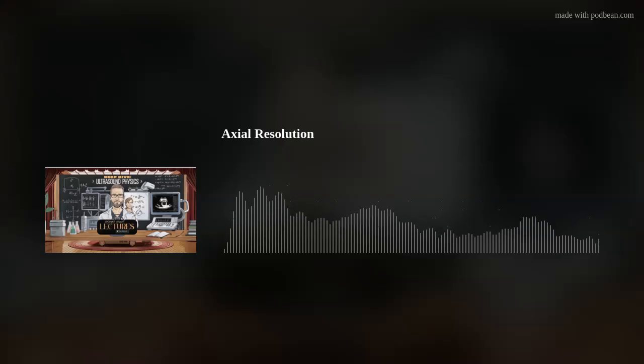No way! So the thickness of the crystal determines the frequency? Yeah, the crystal thickness is about half the wavelength it produces. Thinner crystal, higher frequency, shorter wavelength. Dude, that's insane. But wait, I'm guessing there's a trade-off here.